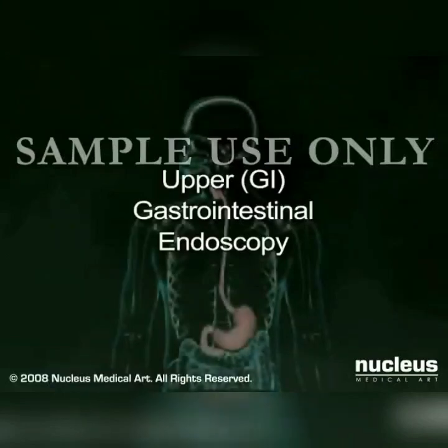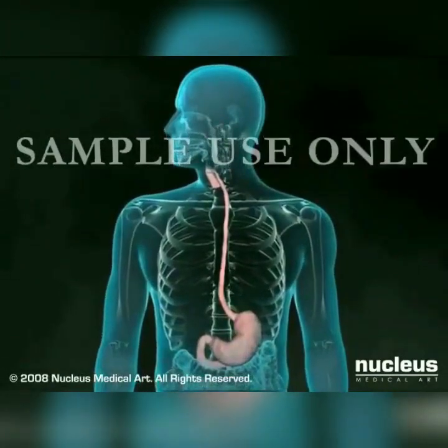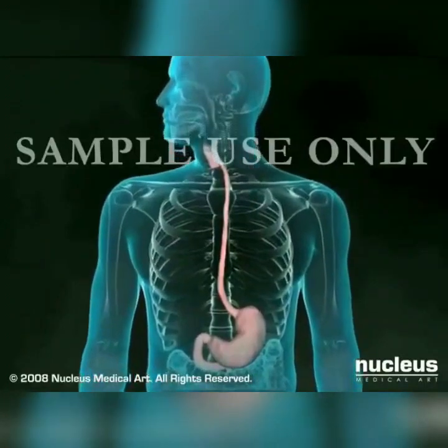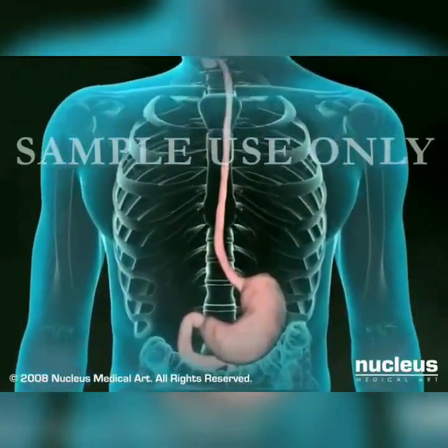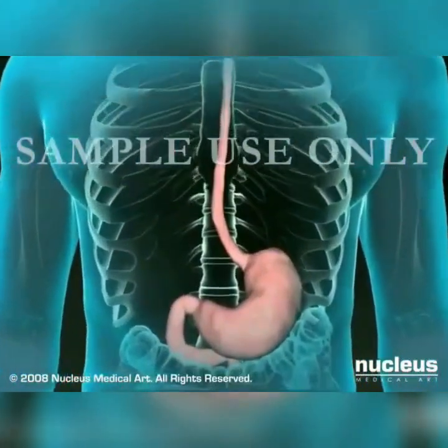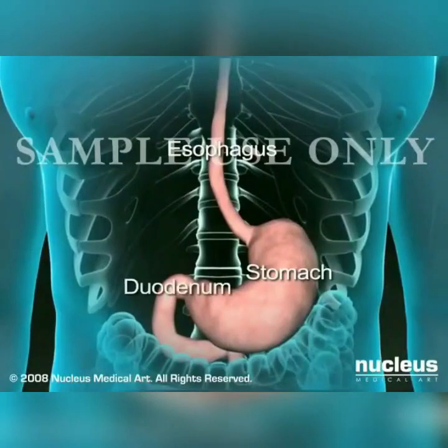An upper GI endoscopy, also called an esophagogastroduodenoscopy or EGD, is a procedure that allows your doctor to view the mucosal lining of the upper portion of your gastrointestinal tract. This includes your esophagus, stomach, and duodenum.